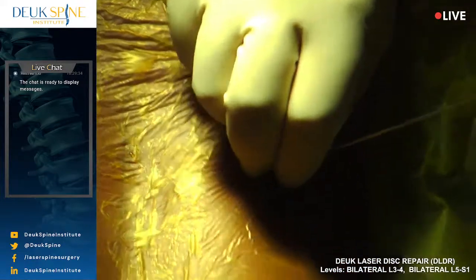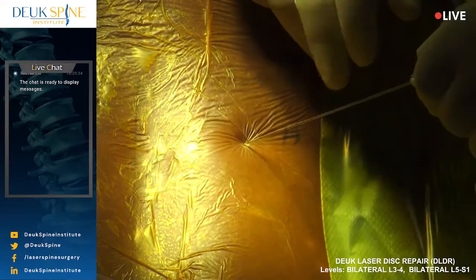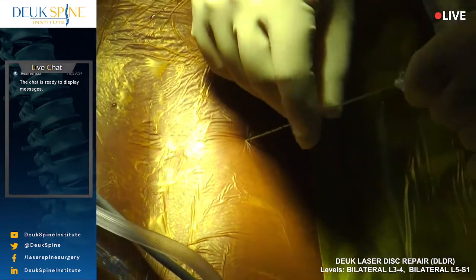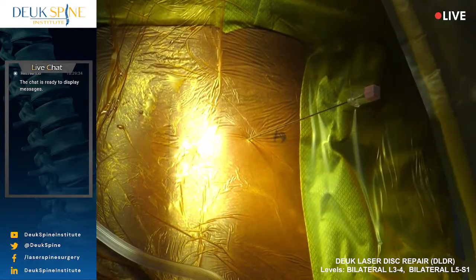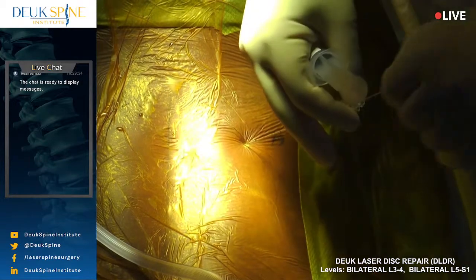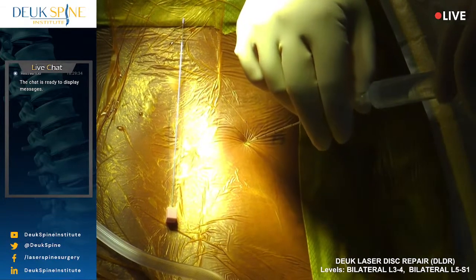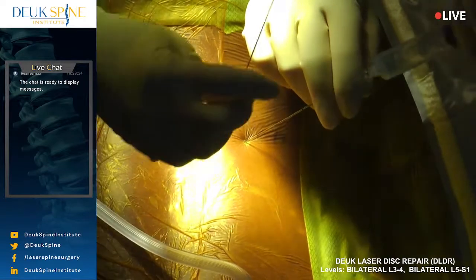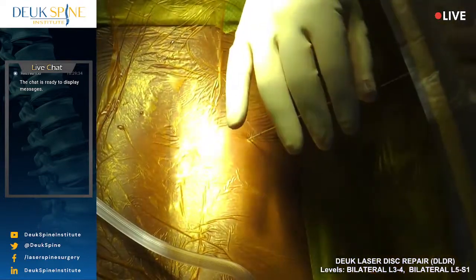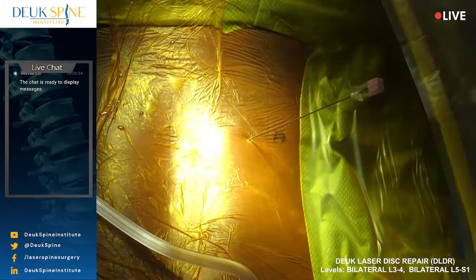Remember, try not to move, okay? If you feel pain, just say ouch, and I'll give you some more numbing medicine. We're going to start on the left side. Numbing. While we're doing the surgery, I'll be talking to my team as well as you, okay? We're going to put you to sleep soon, but not yet. It's going to be about 10 minutes, maybe 15. I just gave you some more numbing medicine. That should start feeling better in a few minutes. So, just bear with me.